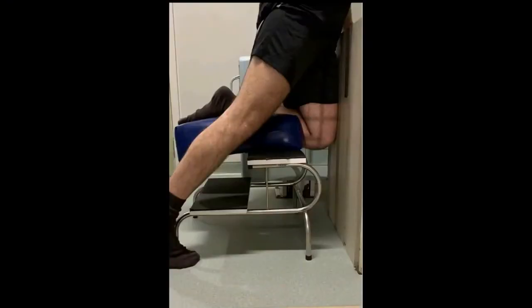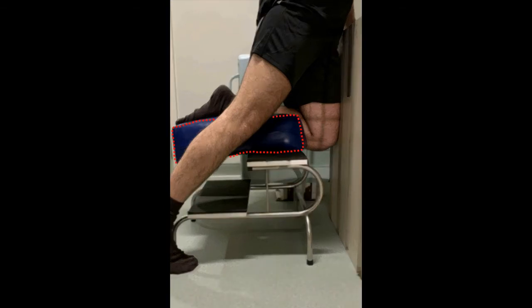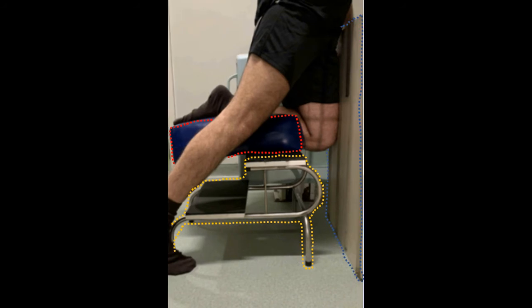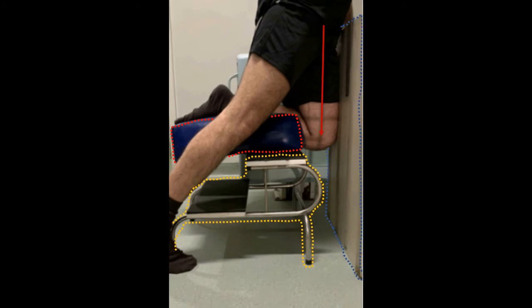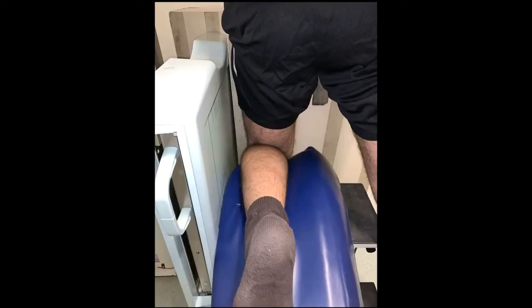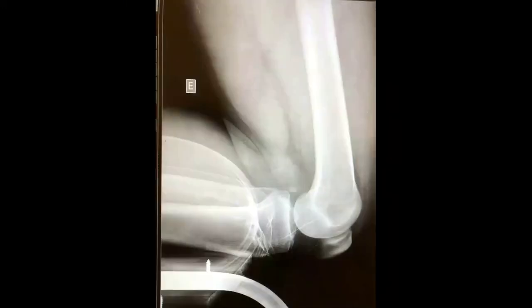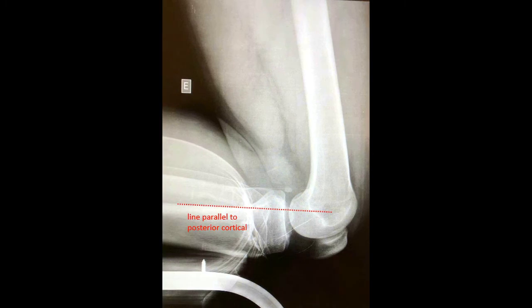To perform the kneeling X-ray to check the posteriorization of the tibia and lesions of the posterior cruciate ligament, we need a thick and a soft cushion, a step ladder, and anterior support. The patient's entire weight must rest on the kneeling limb, with the patient leaning about 10 degrees toward the side being examined to superimpose the condyles on the image. On the radiograph, we draw a line parallel to the posterior cortical tibia at the most posterior point of the Blumensat line and check the distance between the line and that point.